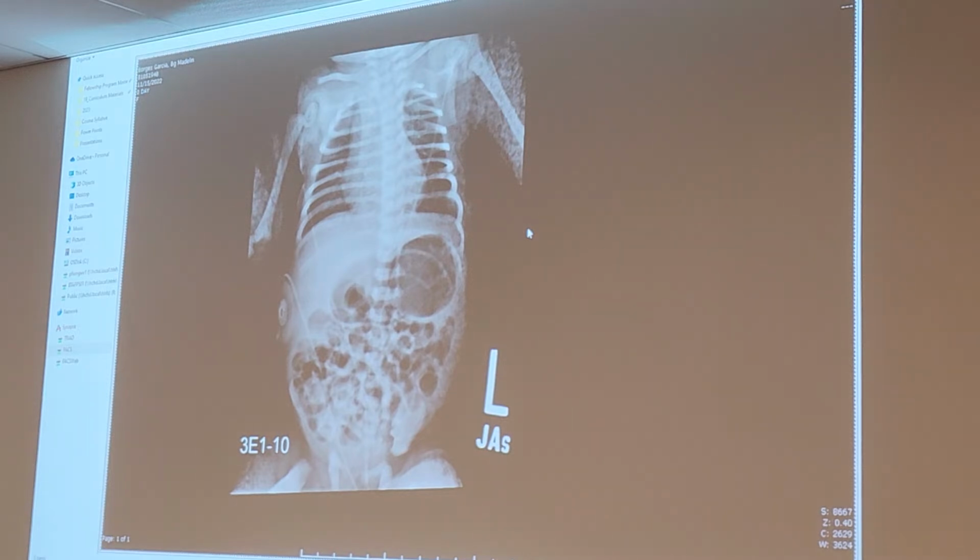So, the number we have here from Carestream, this is not an S value. This is some data that got improperly stored in the S value variable. So this is giving you no information about the S value. You can think of this as a bug, right? A computer bug. This is not the S value.